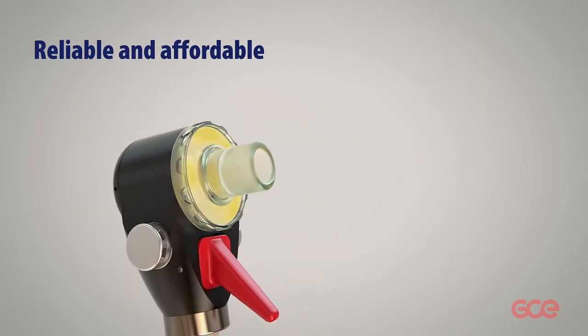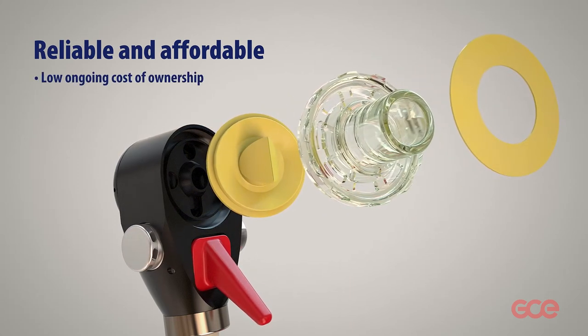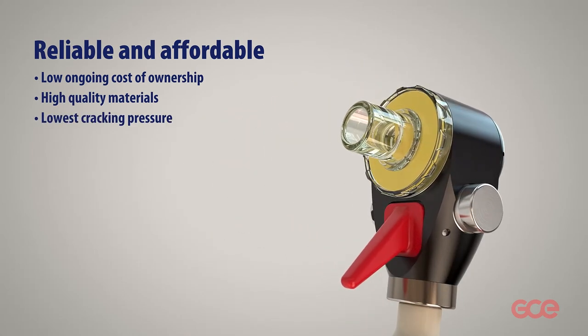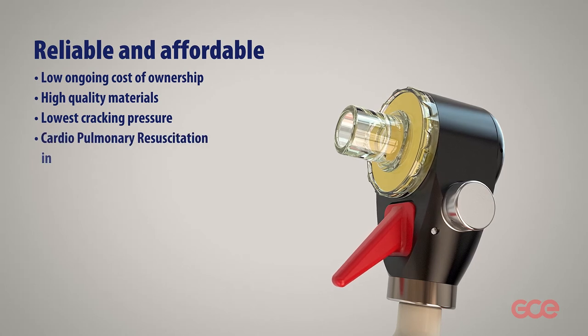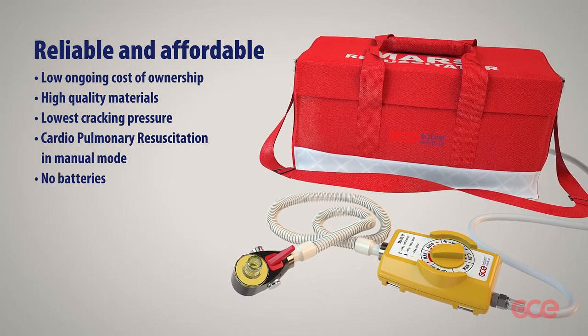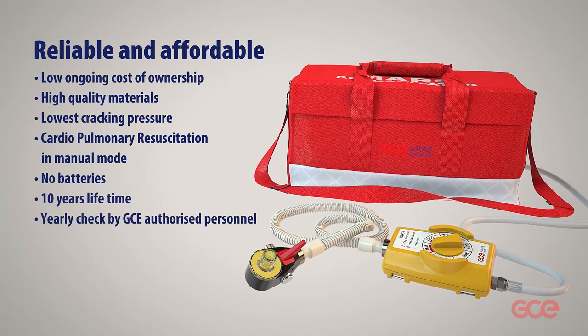Mars 2 offers a low ongoing cost of ownership due to its high quality materials and lowest cracking pressure, making it very sensitive. CPR is possible in manual mode. It requires no batteries, has a ten-year lifetime, requires only a yearly check by GCE authorized personnel, and fulfills all requested standards.